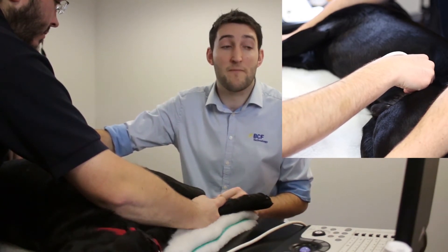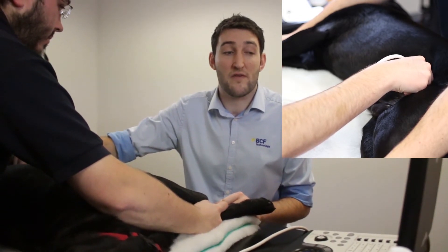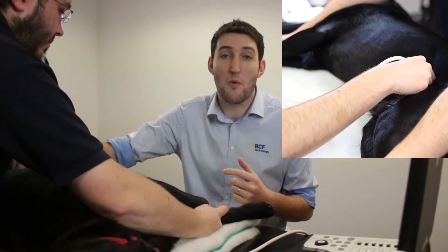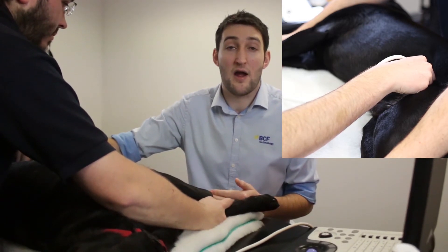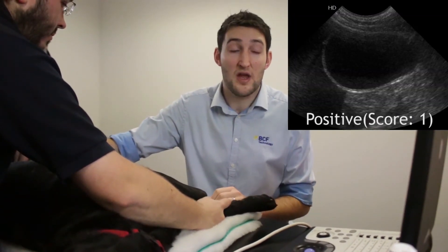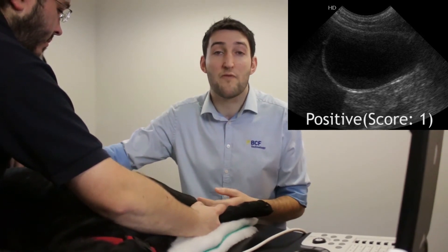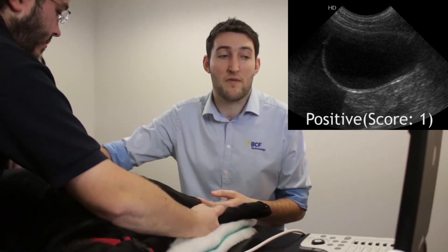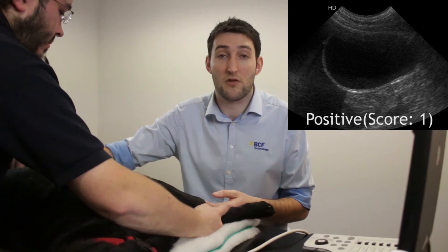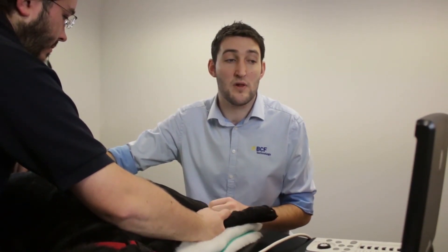Basically we're just going to find the bladder and then again just fan backwards and forwards ever so slightly. What we're looking for is fluid lying between the dependent part side of the bladder — so in right lateral recumbency it'll be between the right side of the bladder and the right body wall, just in that sort of triangle where the bladder is lying up against the body wall.